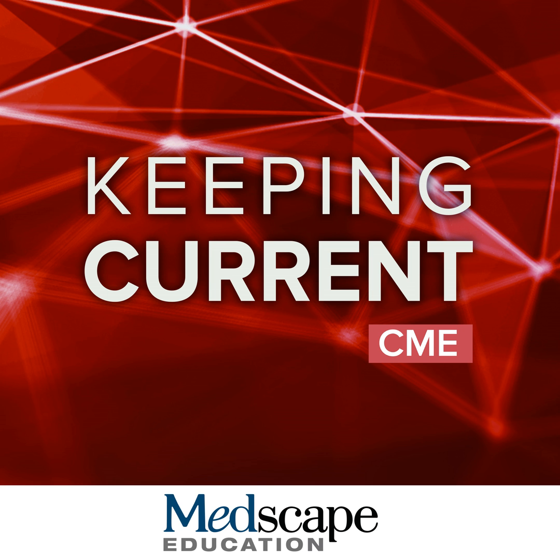The next question is, how helpful is gadolinium contrast to differentiate mimics from ARIA? Generally, in the ARIA assessment and in a typical AD therapy monitoring exam, gadolinium is not necessary, and with the appropriate clinical history and diffusion weighted imaging, a big help to differentiate ARIA from ischemia, we can usually work out the pathology.